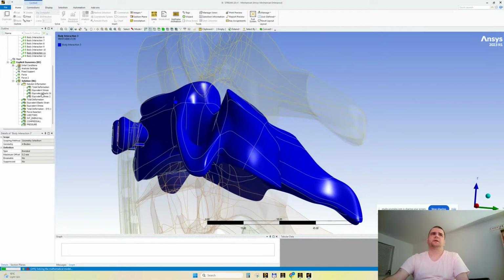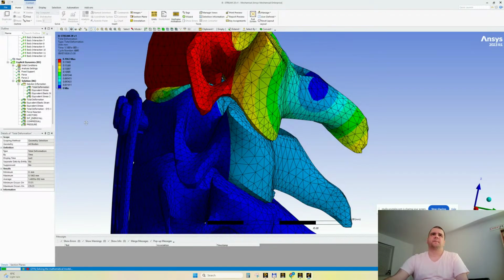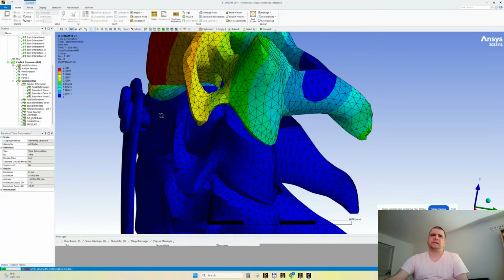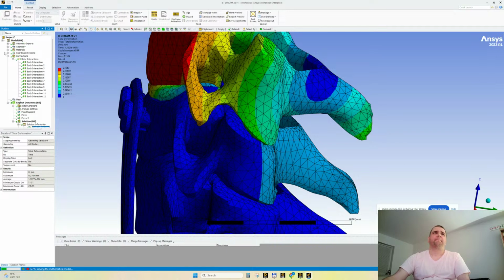I'm contemplating having to apply a displacement, maybe, instead of force. The problem is the cartilage is so elastic, it gets squeezed and it doesn't propagate the force. There is this solution. Either I make harder, stiffer cartilage. Yes, this is the only solution, to make a stiffer cartilage.